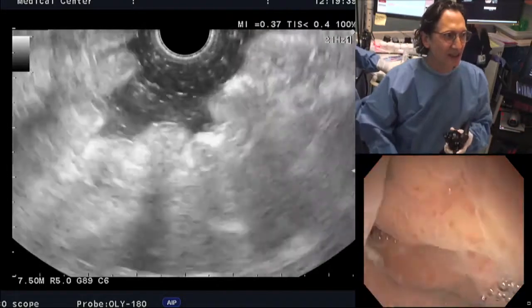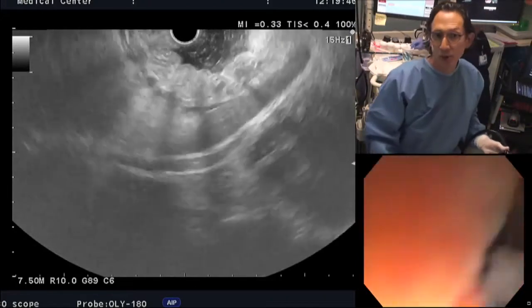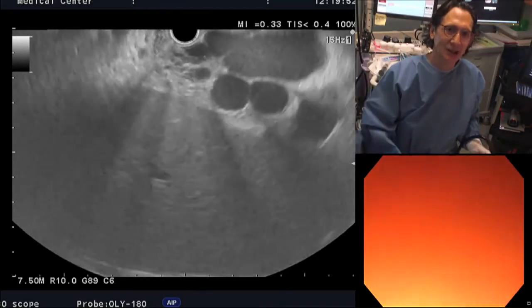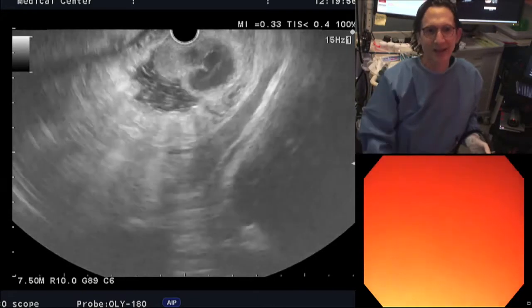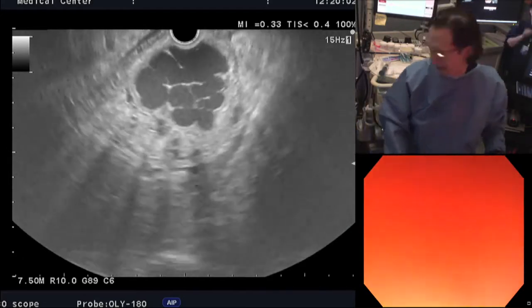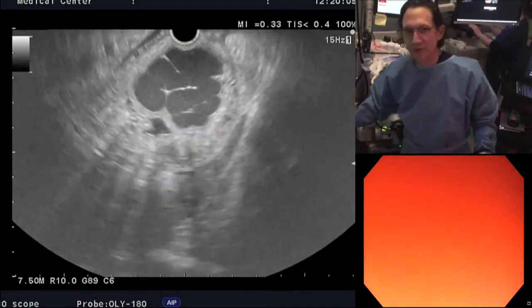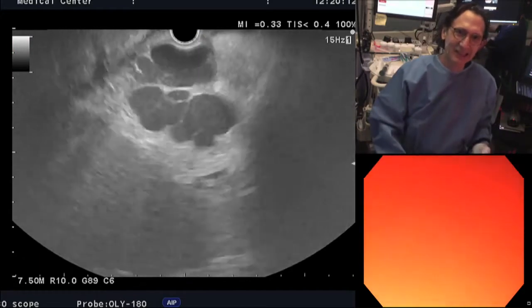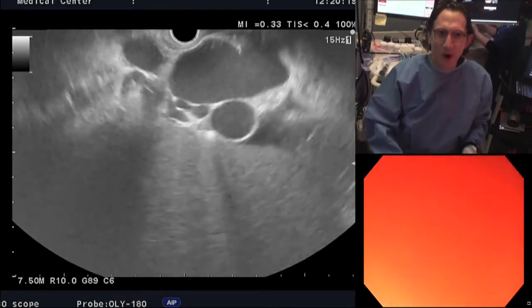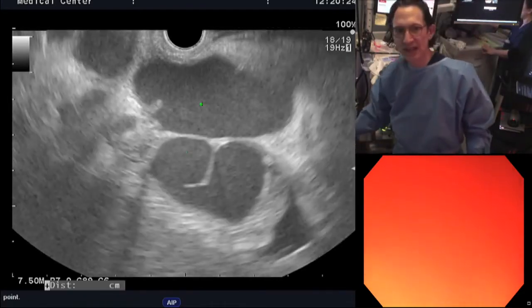But the good news is that the water preferentially goes to the fundus. That's not always good news when you're trying to look at a submucosal lesion in the antrum, for example. But here, it's good news. Now, on EUS, I don't even think I have to show you what you're looking at. I think everyone sees it. These are gigantic. They've got lots of vigorous flow. And it just kind of goes everywhere. Back here, there's a splenic hilum. These are massive. Massive, all right? Let's just measure this out.